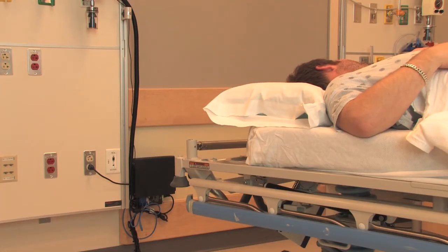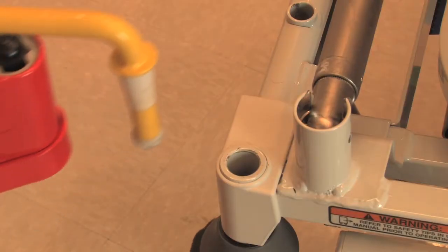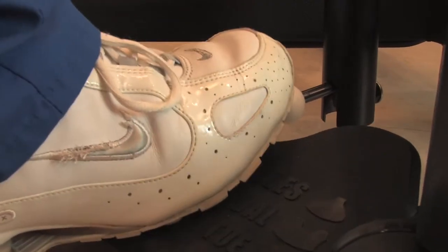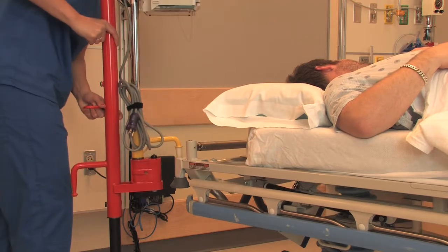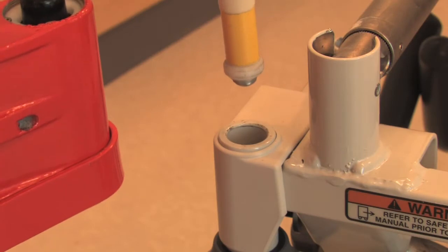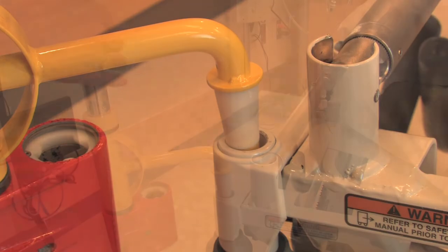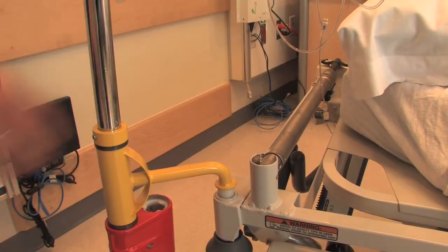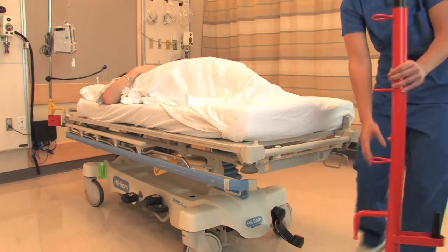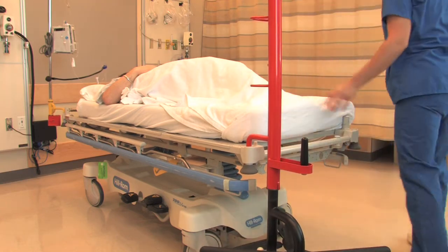When preparing to transport the patient, the nurse grasps the handles, rolls the ZipLift stand to the corner, and positions the yellow receiver pin over the IV socket. Using the foot brake to hold the stand in position, the nurse presses the ZipLift stand lever, lowering the IV transfer pole into the IV socket. In the event that the yellow IV transfer pole does not completely seat within the bed's IV socket, do not be alarmed. Simply grasp the pole and allow it to seat within the socket. Roll the ZipLift stand to the side, and the patient is ready for transport. If the ZipLift stand is needed during transport, just place it onto the existing IV sockets in the bed.